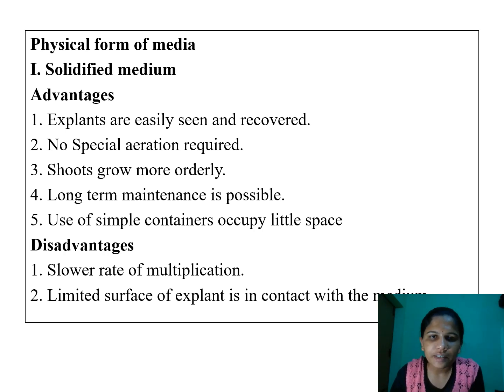We can easily place the explant and easily recover it if there is any problem. And here there is no excess air, no need to provide excess aeration. And shoot growth is normal and we can expect it in an orderly manner.